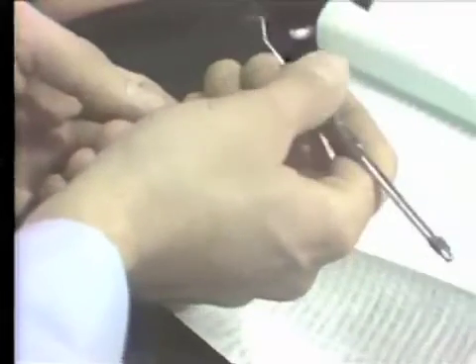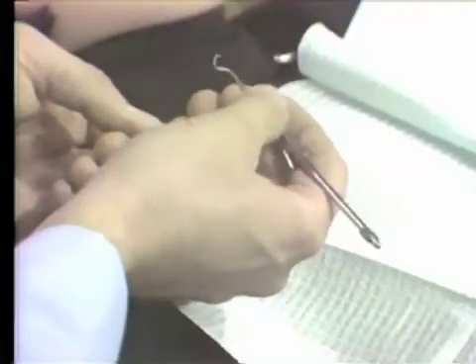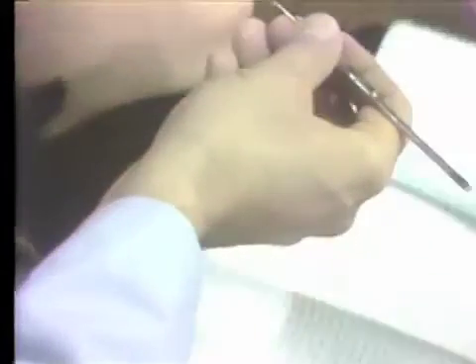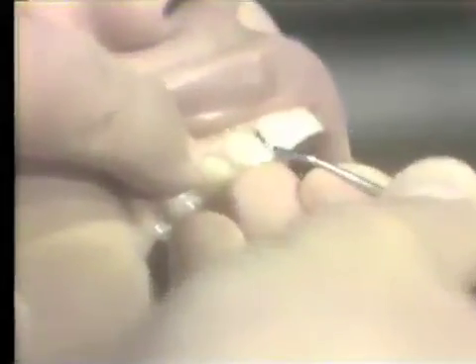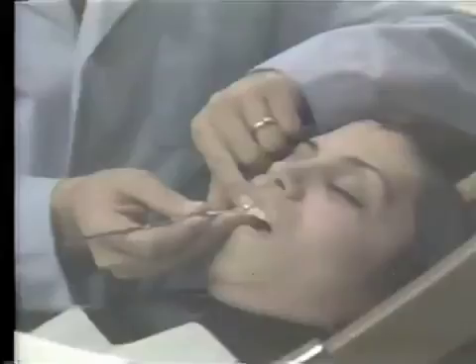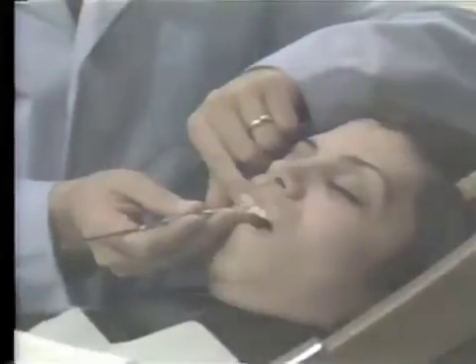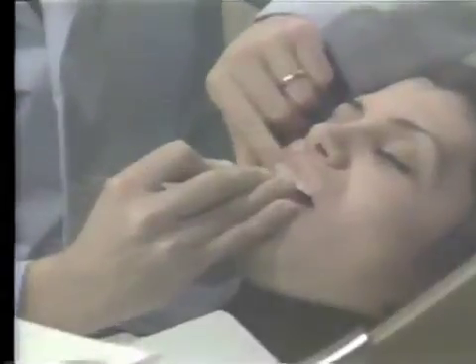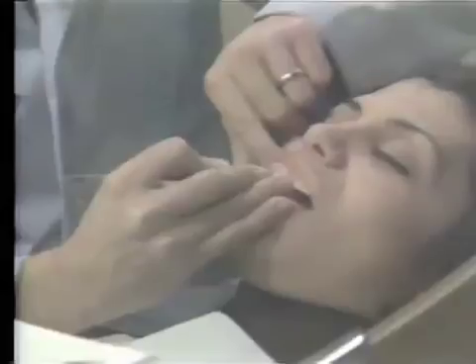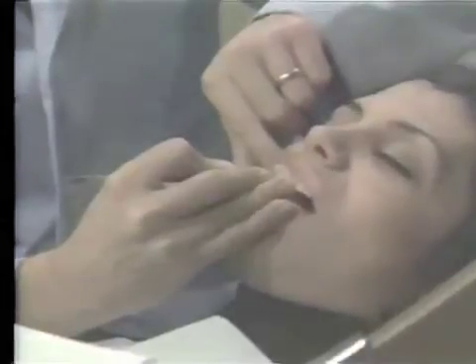First, let me demonstrate to you the instrument grasp used for scalers. The basic grasp is a pen grasp. Taking the scaler and placing it in the mouth, the pen grasp is used in all areas. Many times I have seen the pen grasp used incorrectly — a pen grasp such as that is uncomfortable for the operator and will quickly tire the operator's hand.